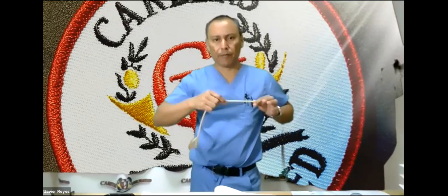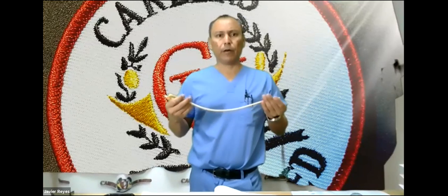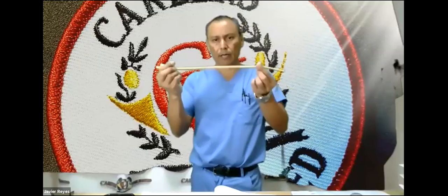Now, there's a little caveat, a little catch. If you work in a facility, and you know how to do this, and you have a good relationship with the nurse, and I know that you are good at patient care, you're very knowledgeable, I will tell you, I can delegate that to you if it's in your scope of practice and if the facility policy also allows it. I can tell you, Erica, go ahead and place a Foley on such patient, and I'll tell you the size and what kind of catheter it's going to be, indwelling like this one, or an intermittent kind of catheter. It just depends on the condition of the patient.